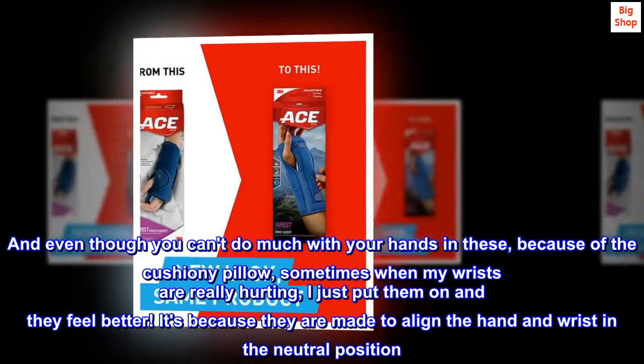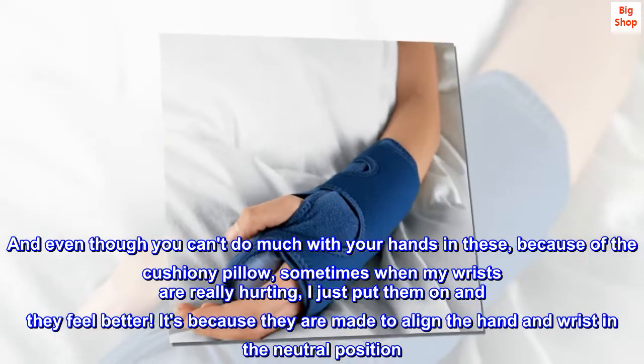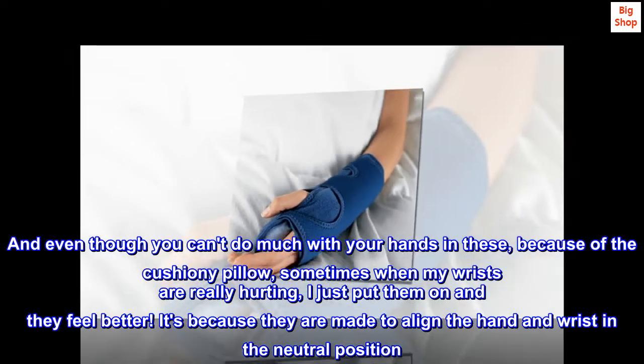And even though you can't do much with your hands in these, because of the cushiony pillow, sometimes when my wrists are really hurting I just put them on and they feel better. It's because they are made to align the hand and wrist in the neutral position.